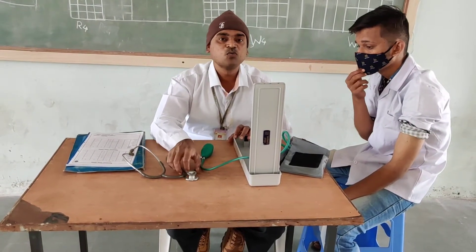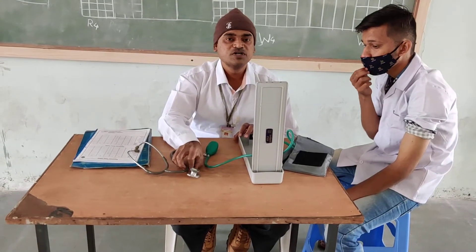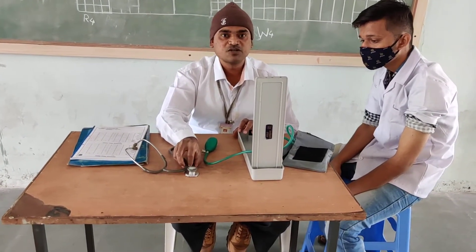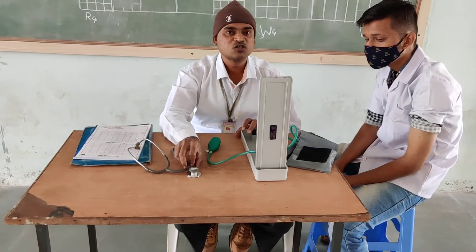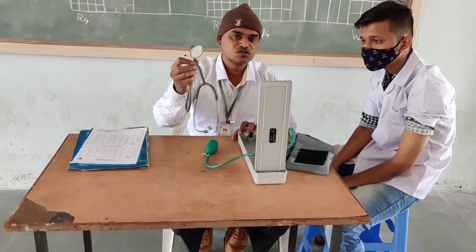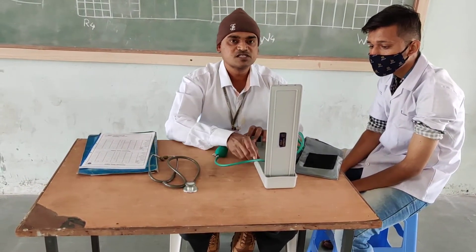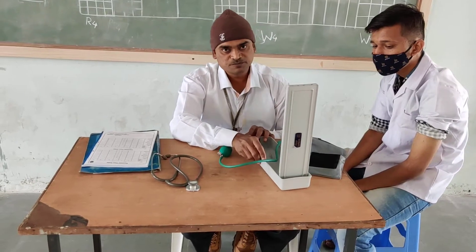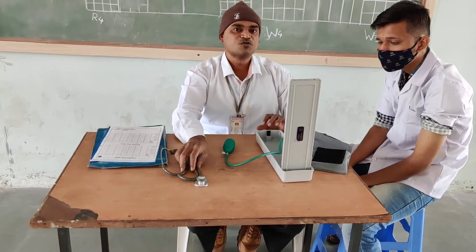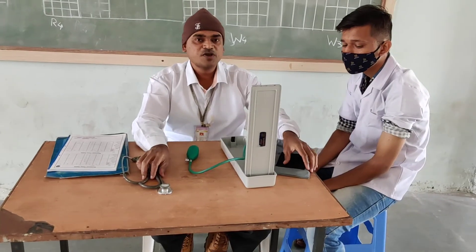In this practical, we are performing the determination of blood pressure. For this practical, we require two instruments. We require this stethoscope, and we require this sphygmomanometer. We also require one subject, one patient.